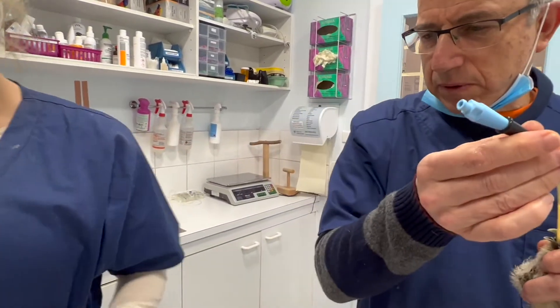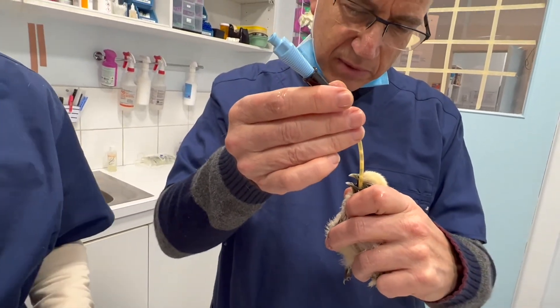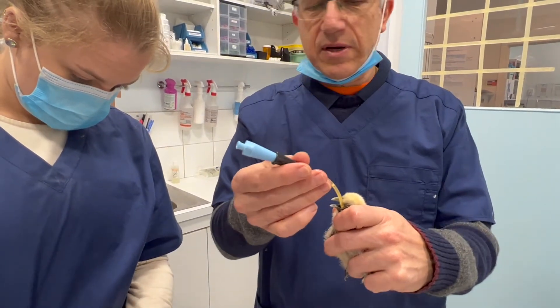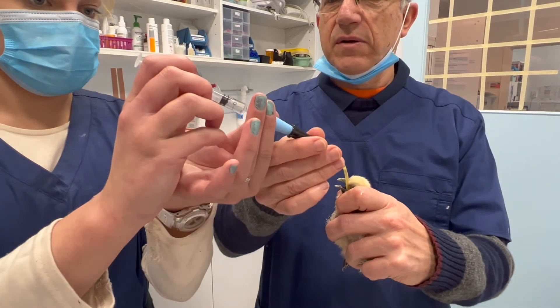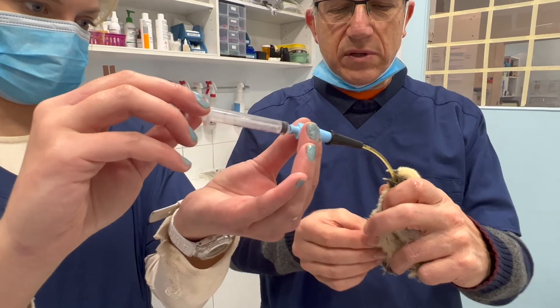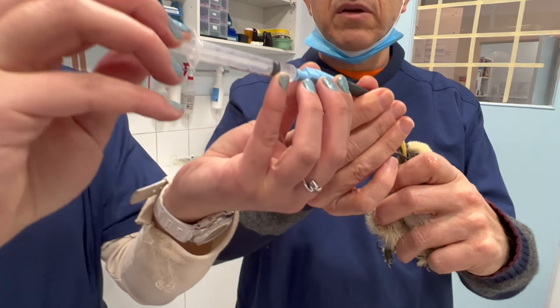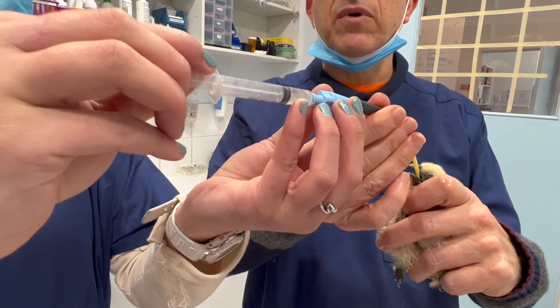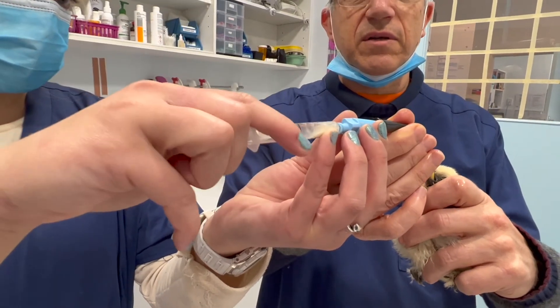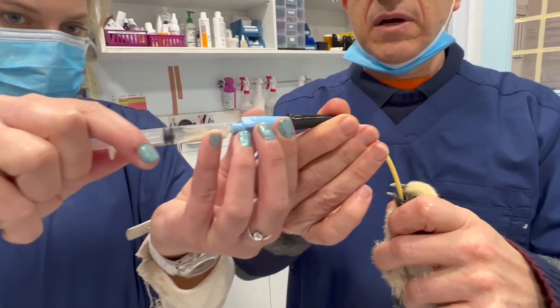Get one with a little bit. Draw up half a mil — one mil of water or half a mil of water. Just a little bit less — go to about one mil. Inject that in. Hold on, keep hold, just hold so it's supporting it. Okay, now inject. Now suck — slowly, brilliant. Carry on, brilliant. Carry on, brilliant. Stop, push forward a little bit. Okay, suck.